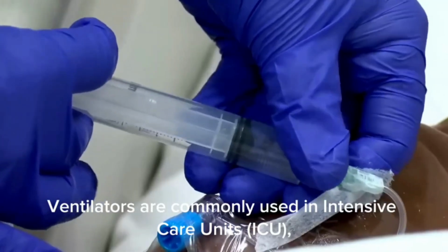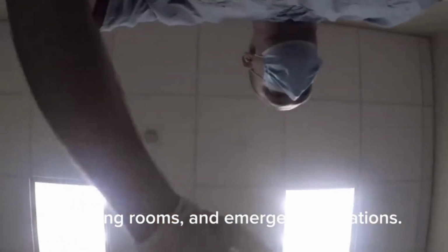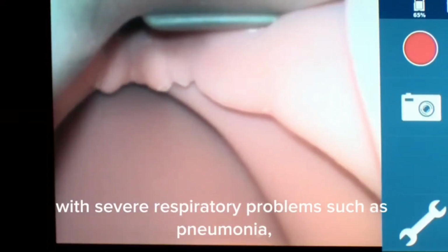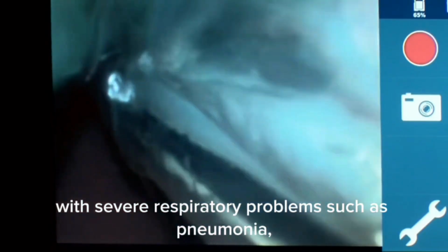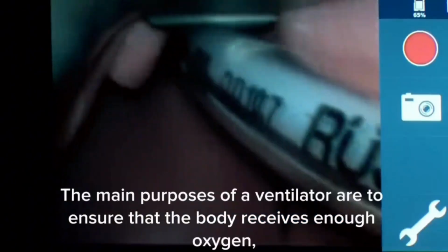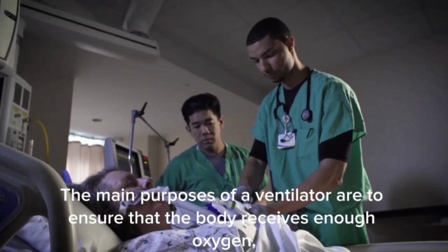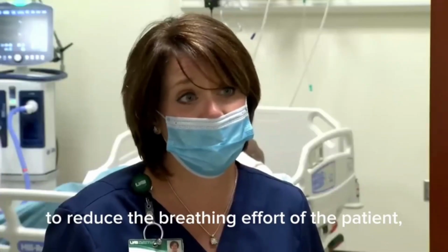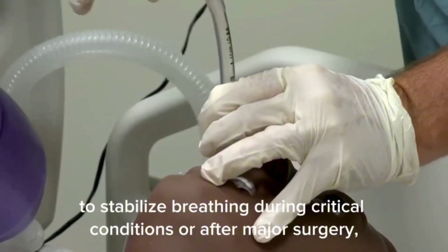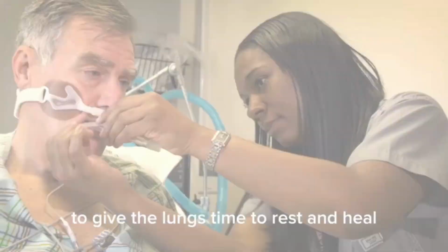Ventilators are commonly used in the intensive care unit, which is ICU, operating rooms, and emergency situations. They are especially important for patients with severe respiratory problems such as pneumonia, lung failure, chest trauma, or infection like COVID-19. The main purposes of a ventilator are to ensure that the body receives enough oxygen, to reduce the breathing effort of the patient, to stabilize breathing during critical conditions or after major surgery, and to give the lungs time to rest and heal.